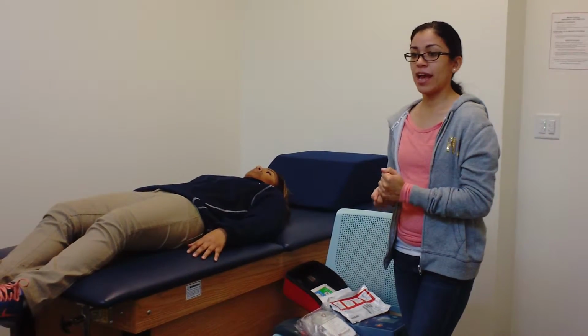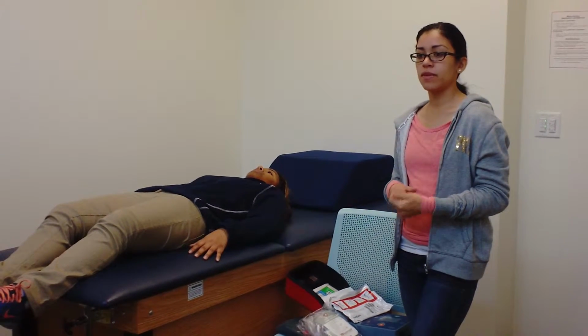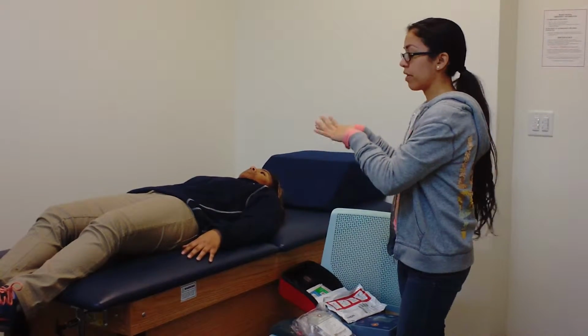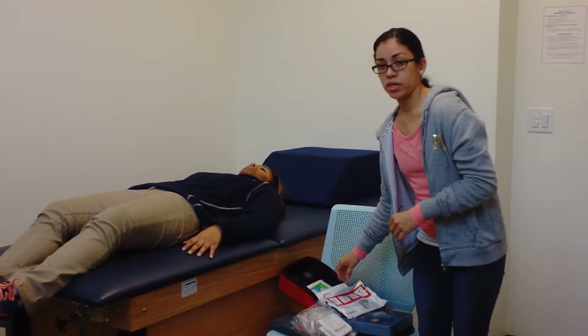Also, does the patient have any piercings? Does the patient have any implanted device or a pacemaker? What I need to be aware of is where that implant or device or piercing is located, and apply the pads at least 1 inch away.